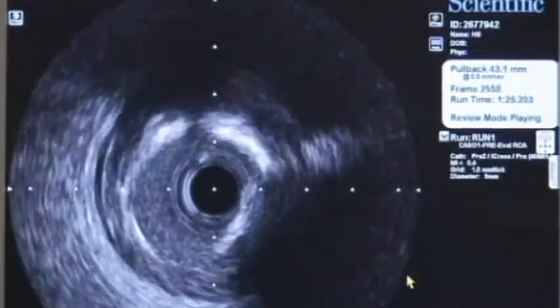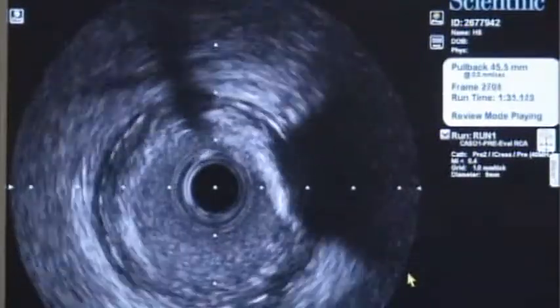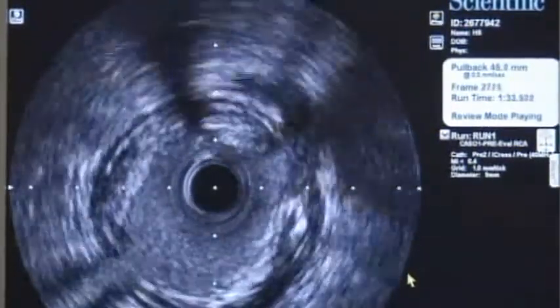So, Majoni? Okay. Have you seen the IVUS run?